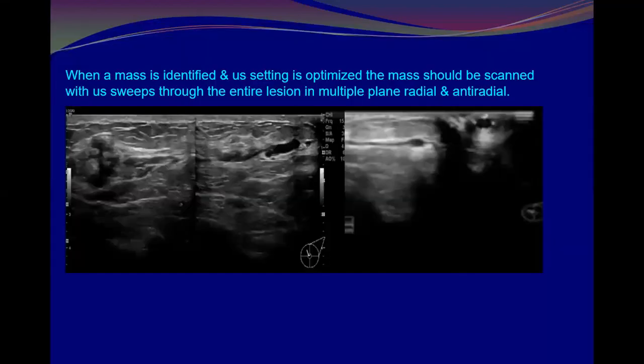And what is going on here? This is again a heterogeneous, suspicious lesion, but when I also see the irregular ducts going down to the nipple, and even here a papilla within the nipple is stretched and dilated, that means if it is seen only here, it will be BI-RADS 4C, but along with this ductal extension, definitely it will be upgraded to BI-RADS 5.